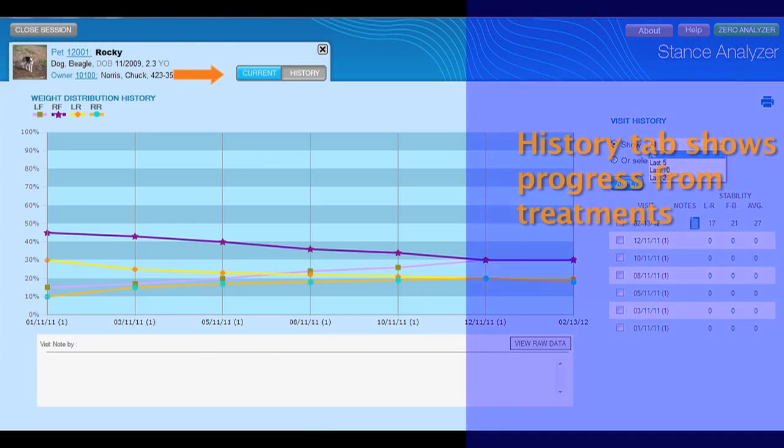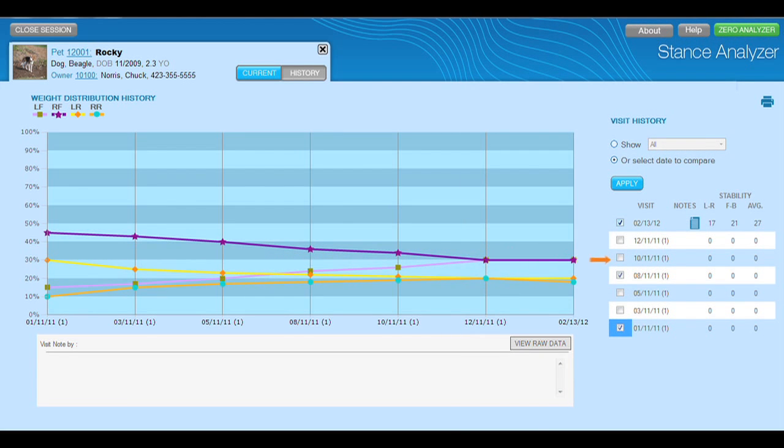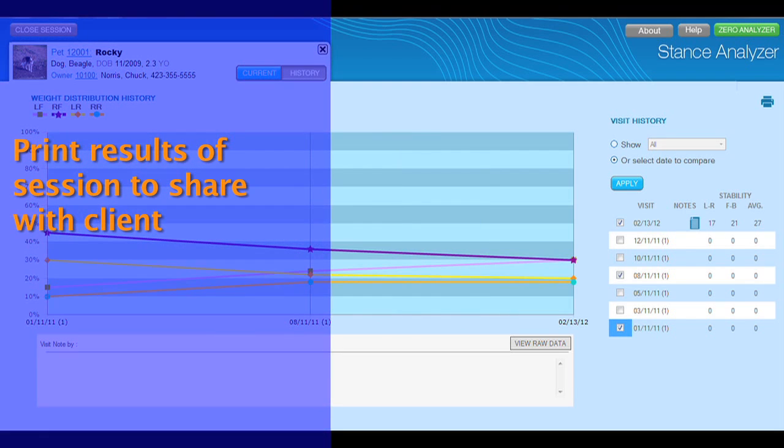Now let's look at the history tab. This screen graphs the average data from each visit, which allows you to evaluate the treatment plan you have implemented. You can isolate just the last 5, 10, or 20 visits, or you can graph only the sessions you select. You can also print these graphs by selecting the print button. This is a great tool for tracking your progress and sharing results with your clients.